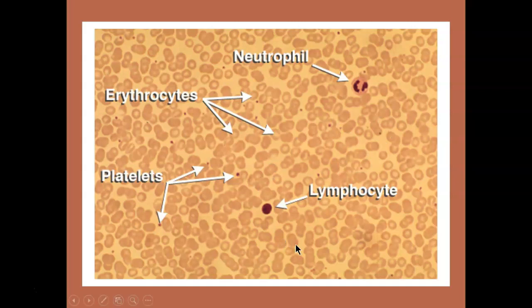Here you have a neutrophil and a lymphocyte — two types of white blood cells — and you can see they appear very differently. All the little purple spots that look like sprinkled pepper are your thrombocytes, or platelets. Platelets are responsible for blood coagulation and stopping bleeding, a process known as hemostasis — not homeostasis — where 'hemo' means blood.